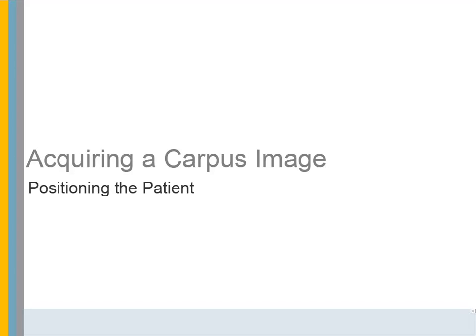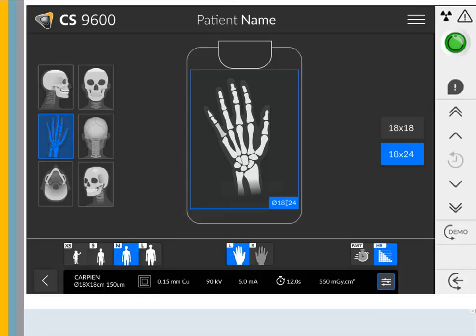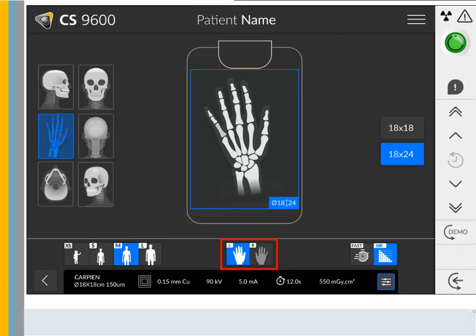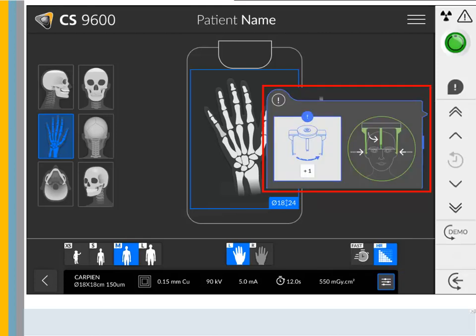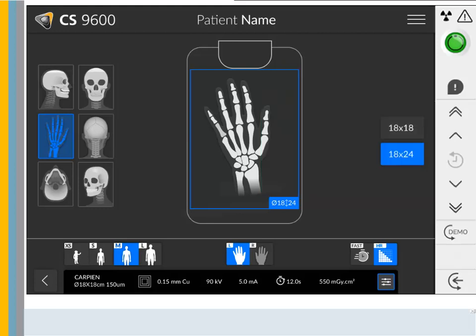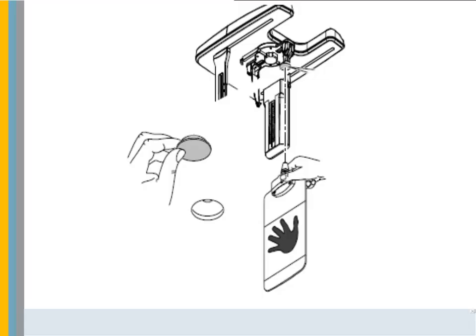Acquiring a Carpus Image — Positioning the Patient. On the touchscreen control panel, select the carpus program icon and choose the field of view. Select the patient type. Select the hand to be scanned: left or right. Choose the imaging mode: fast or high resolution. If the default parameter setting is not adapted for the patient type, click the Parameters icon and set the parameters. To save the parameter settings, click Save as Default. Manually rotate the head clamps by the number of clicks and in the direction displayed on the position indicator on the touch screen control panel. The position indicator does not display if the head clamps are positioned correctly. To insert the carpus panel, remove the cap and push the carpus panel into the magnetic carpus panel slot.